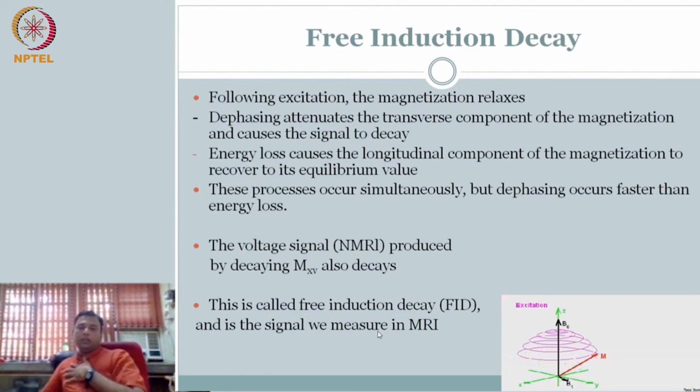Okay. Now the question is, we saw something as T2 star. What does that T2 star mean? Notice how the signal can lose its magnitude. Dephasing, right? When it is dephasing, that means there is a subtle difference between the frequencies of the neighboring nuclei. We talked about spin-spin interaction, that the neighboring nuclei can affect each other, causing some to spin faster, some to spin slower, slightly around plus or minus the omega frequency that you have, the Larmor frequency.